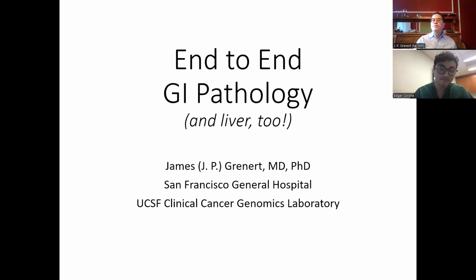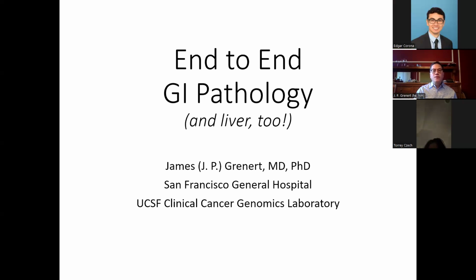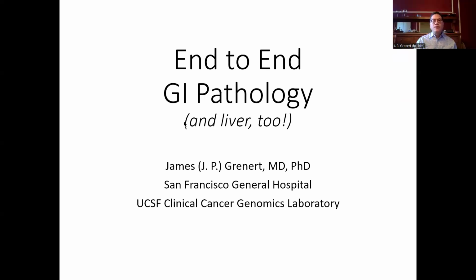Grenert. Thank you so much for giving me the opportunity to talk to all of you. I really value my work with the GI group, and it's been fantastic getting to know so many of you over the years. So the talk today is we're going to go end to end through the GI tract and cover normal histology and some things that you commonly see. There are going to be some new things compared to last year's talk, so those of you who saw this before will see some new things, but we'll also cover basics so that the new fellows will get up to speed. And then also I wanted to make sure that we cover some more liver this time compared to last year.